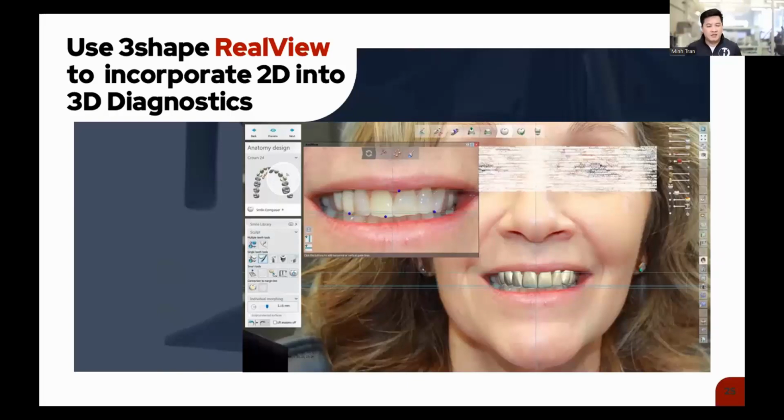Again, it really depends on just how much tooth structure needs to be reduced or added onto and what kind of outcome we're expecting. So if it's only minor cosmetic changes, I can add just a little bit and print that off. If it's more drastic, then I'll produce a few different models. Maybe even I'll give the doctor a few different options.